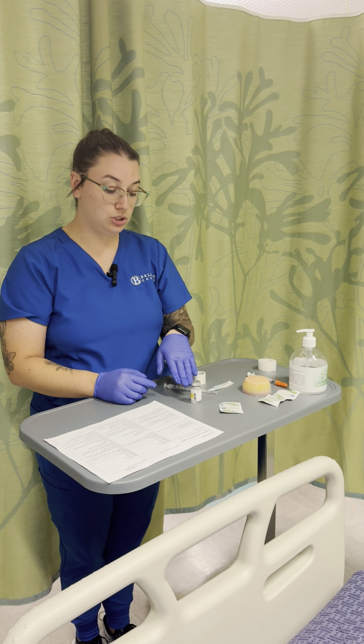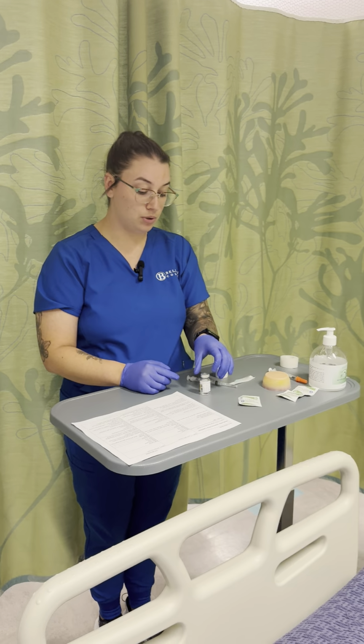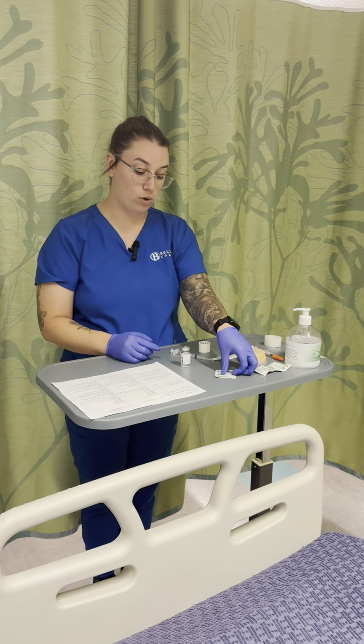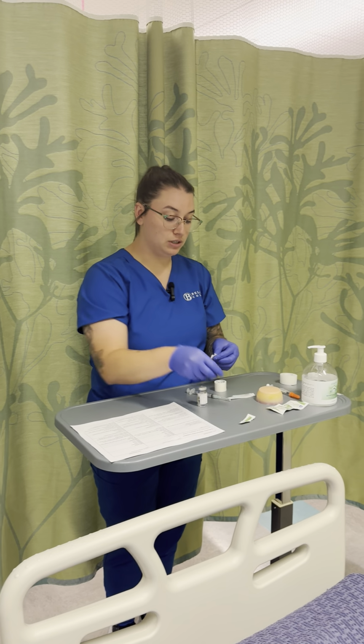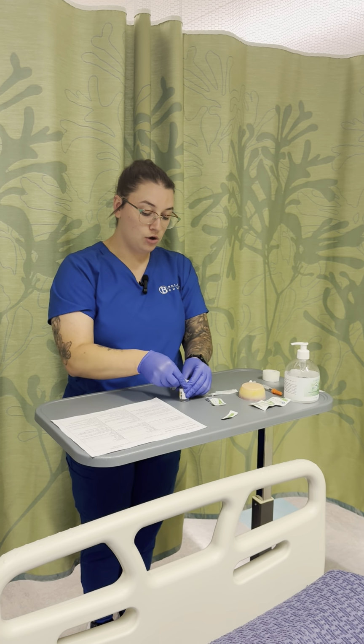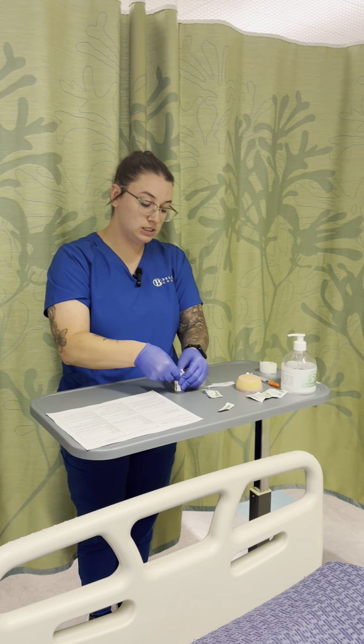So then going back to my ketorolac, I have 15 milligrams here per 1 milliliter. So I'm going to draw up 1.3. I will pop the cap off if there is a cap. I would clean for 30 seconds, making sure I get into all the crevices.